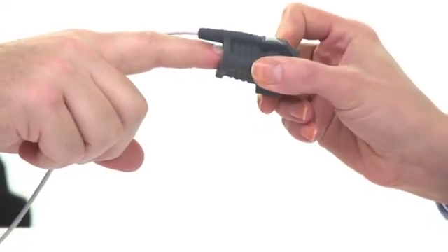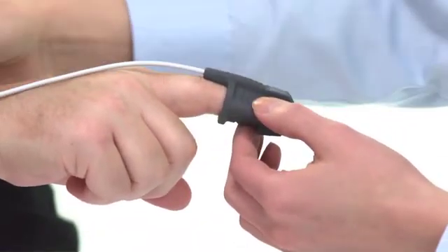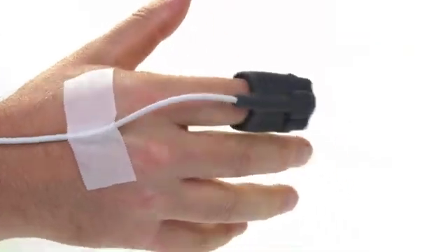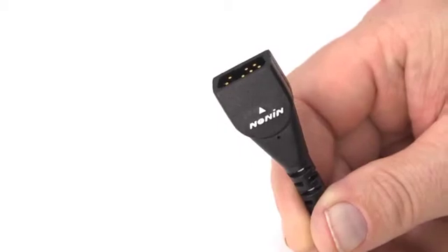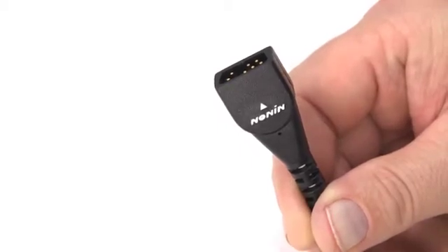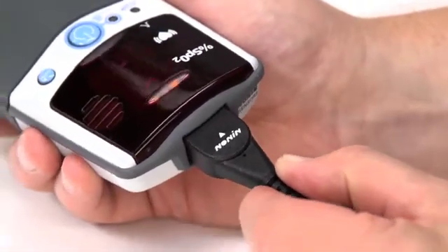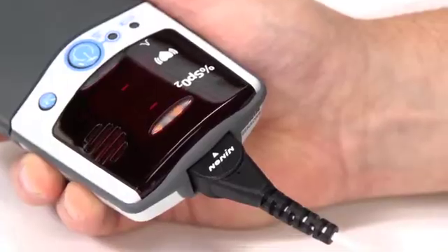Prepare the sensor and place it on the patient prior to connecting it to the oximeter. Proper sensor placement is critical for accurate readings. Follow the instructions for each sensor type to ensure secure, aligned positioning of the sensor on the finger or skin surface. Connect the sensor to the pulse oximeter by inserting the plug with the Nonin logo and arrow pointing to the top of the unit as shown here.